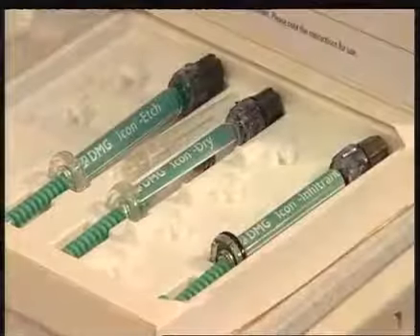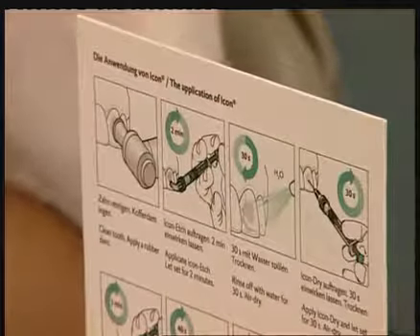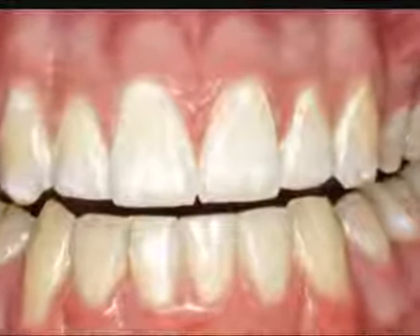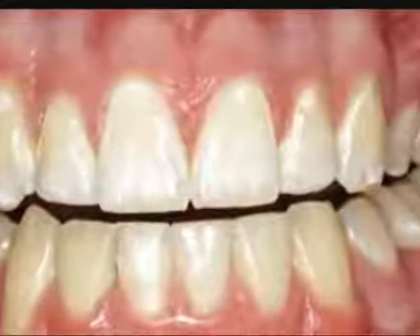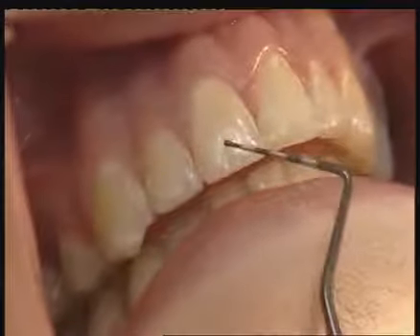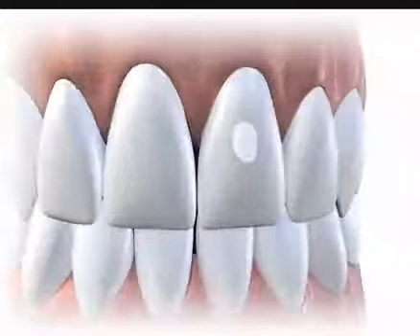DMG's ICON is the first ever caries infiltration product. Caries infiltration offers a totally new treatment method for early caries lesions with non-cavitated enamel and a maximum radiographic lesion depth of up to the outer third of the dentine. Caries-related white spot lesions are not only a disturbing cosmetic problem but are actually a visible early stage of a caries lesion. It is therefore reasonable to treat them at this stage so they won't progress. Caries infiltration offers an ideal treatment method.